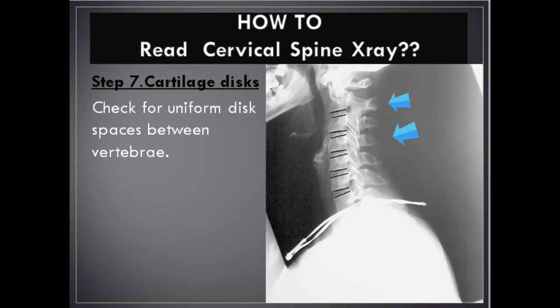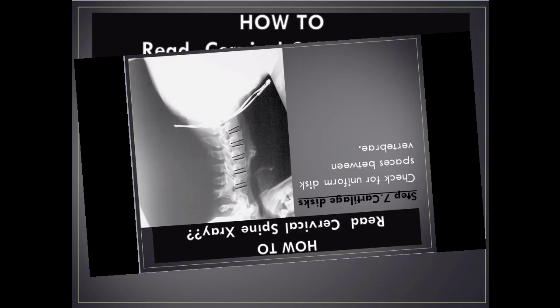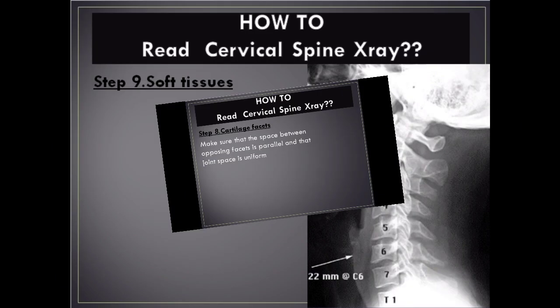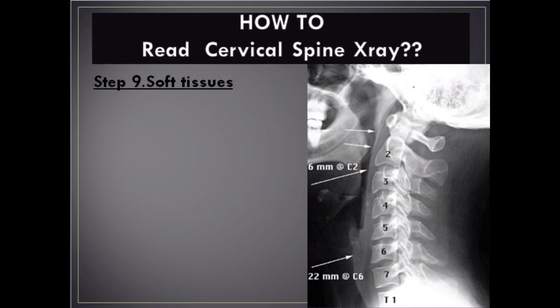Step 7 – Cartilage Discs: Check for uniform disc spaces between vertebrae. Step 8 – Cartilage Facets: Make sure that the space between opposing facets is parallel and that the joint space is uniform.